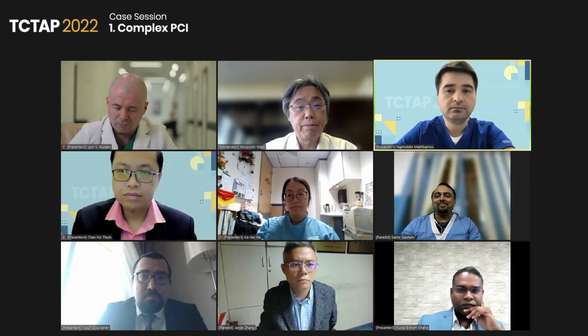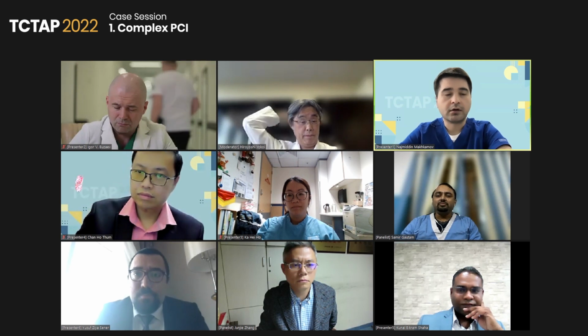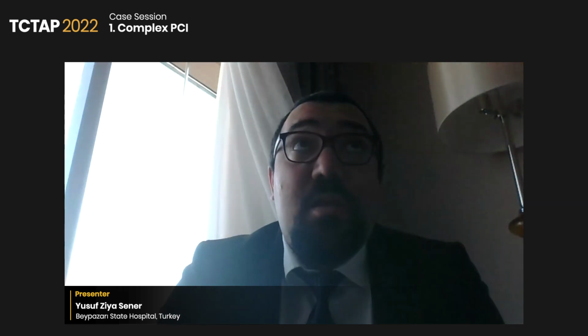May I ask one question? Oh, please, John. Thank you very much, first of all, for your nice presentation, and I would like to ask you about the cerebral intervention. For neural intervention, do you mostly use the radial artery approach or the femoral artery approach? In Turkey and in our hospital, usually intracranial interventions are performed via interventional radiology, and in most cases they use the femoral artery.